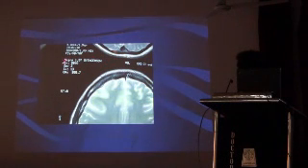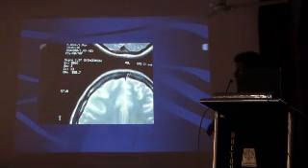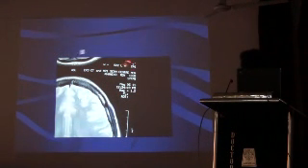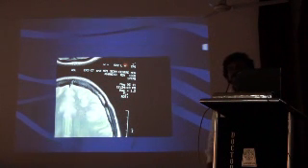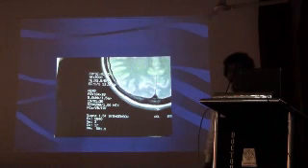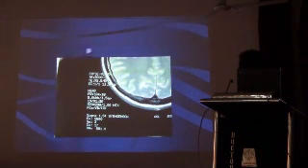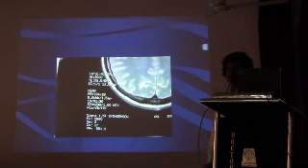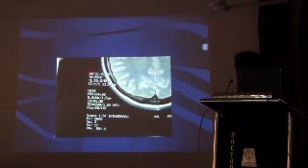Now what we look at in an MR film is the top left corner: the machine parameter, examination number, series, image number. These are the important things you have to check. On the top right hand corner, the patient's name, date and when it was done. And the important thing is the lower left corner. What you have to look at?